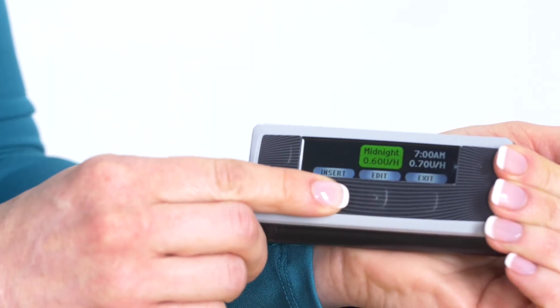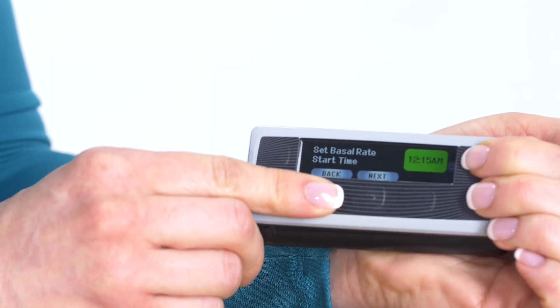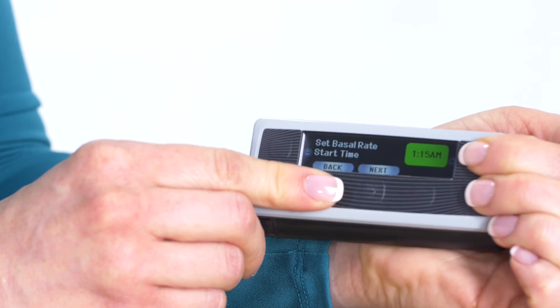If you're currently taking insulin injections or using a pump, you're familiar with the term basal rate. This refers to the constant small amount of insulin delivered during the day through your pump. You may have several different rates during the day and this is called a profile. You, along with your health care provider, can develop different profiles to fit your lifestyle.